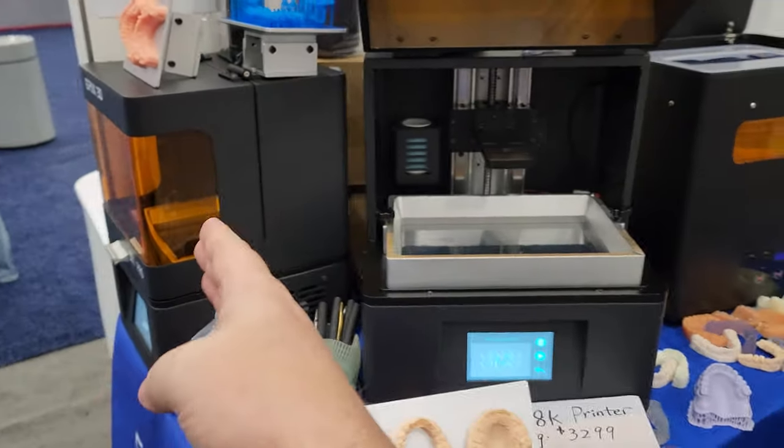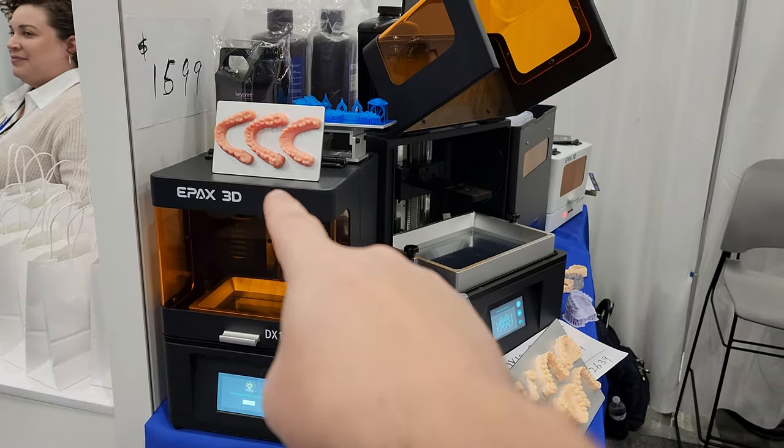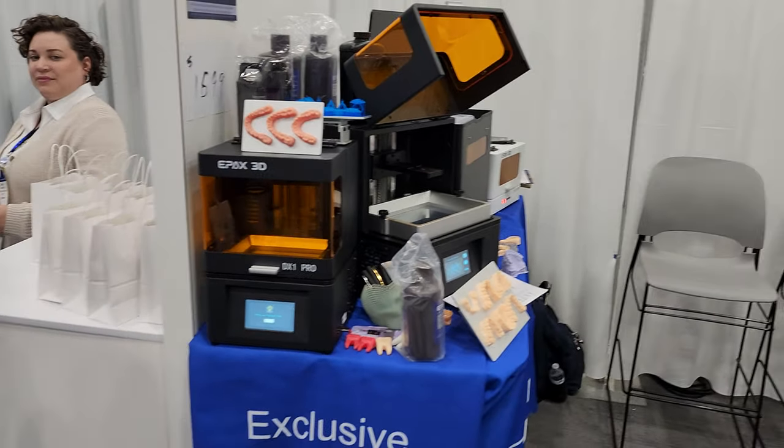Starting over here with the DX1, it looks like you could do three different molds at once? Actually four. You could do four at once? Yeah — depends on how you lay them out.